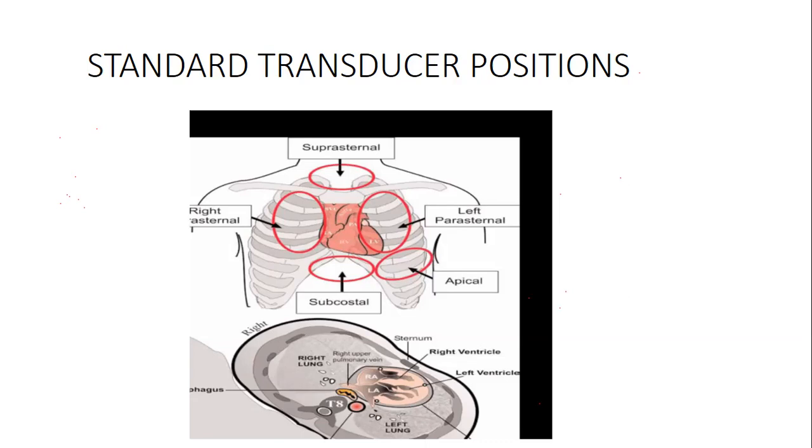You can also modify this and twist and get your 5-chamber. Don't be surprised when you find that people are talking about the 5-chamber. It's through this 4-chamber view that you can pick the 5-chamber view. This is also where you can quantify issues of diastolic function. It's the apical 4-chamber. I'll still demonstrate how this comes about. So apical 4-chamber, very important.